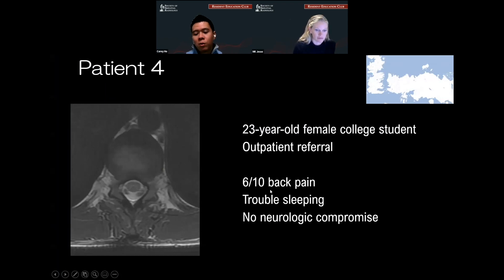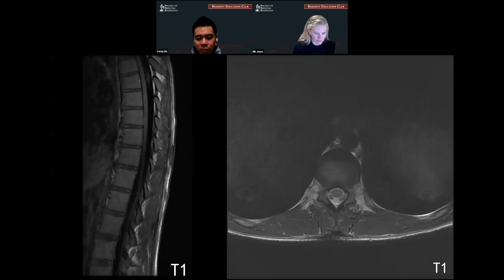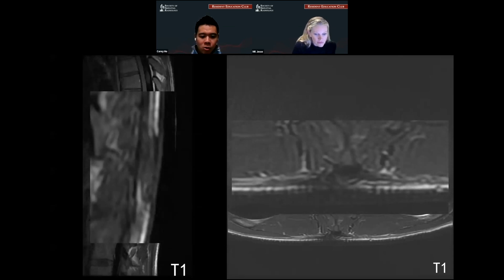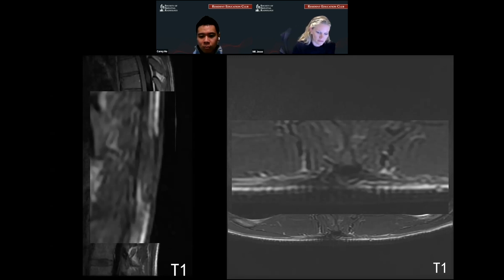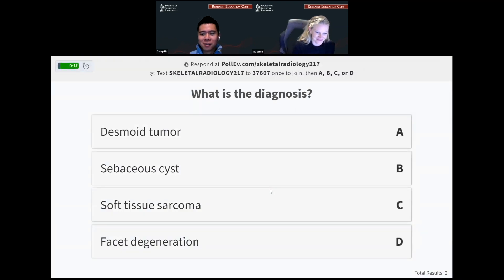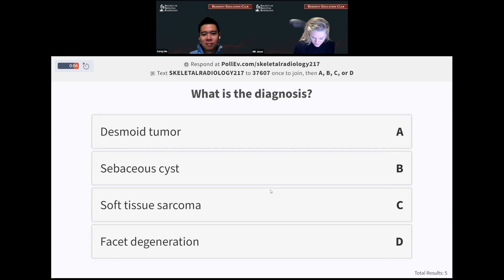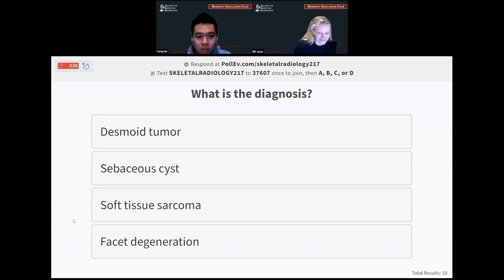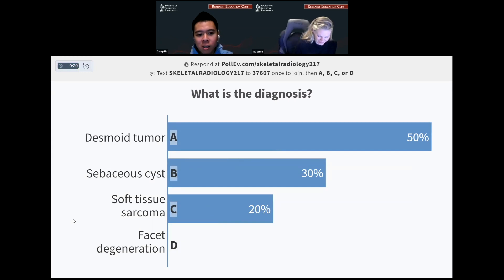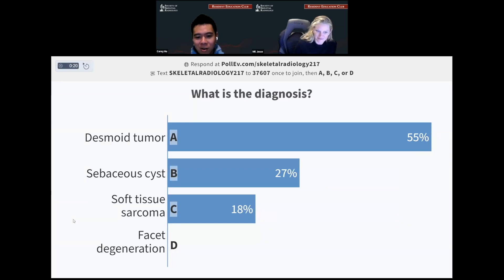Patient four is a 23-year-old female, outpatient referral, 6 out of 10 back pain with trouble sleeping, no neurologic compromise. We have axial and sagittal T1 images from the MRI. There's hypo-intense T1 subcutaneous or abnormal subcutaneous tissue within the spinal soft tissues. What is the diagnosis? We got a little bit of mixture here — desmoid tumor, sebaceous cysts, and soft tissue sarcoma. The answer actually is a desmoid tumor.